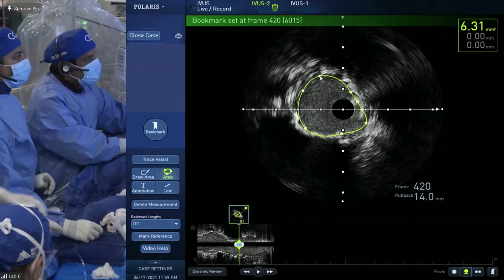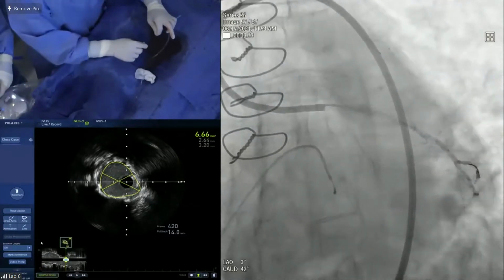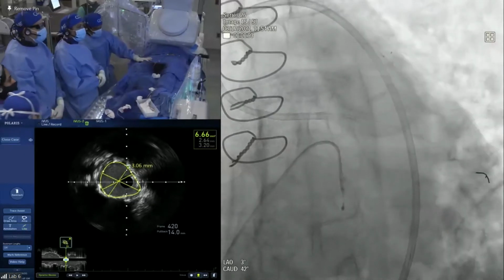So, I mean, this is still on. Good. At least the stent has been expanded. Let's go. A lot of disease we know. We put a long stent. Did you hear that? Wonderful result. How did it work?